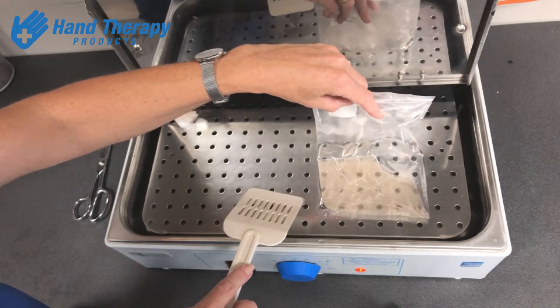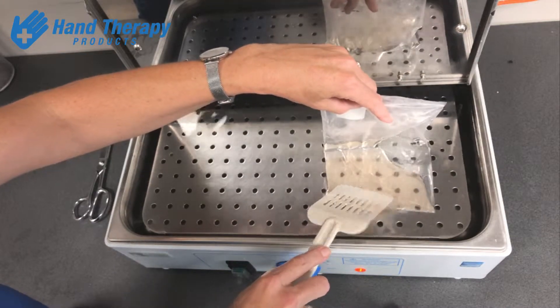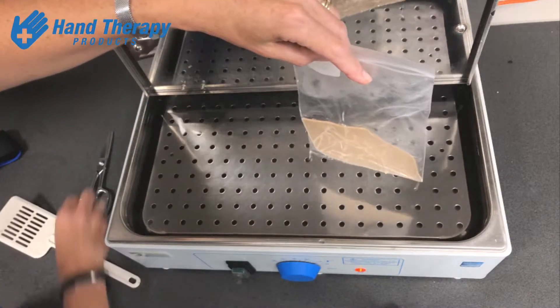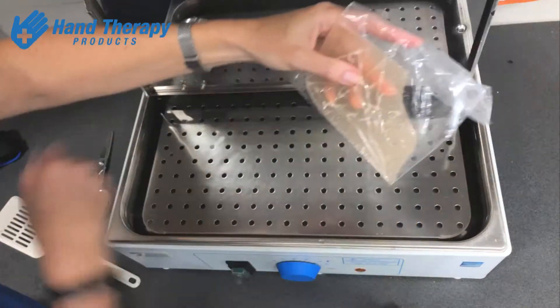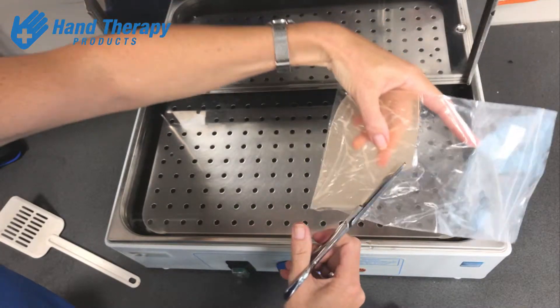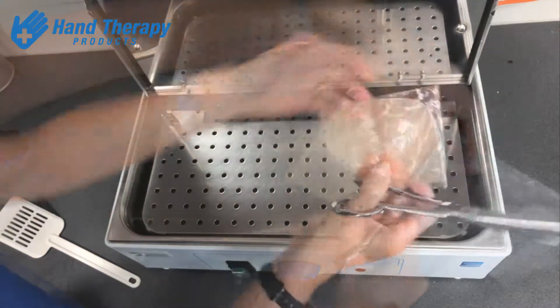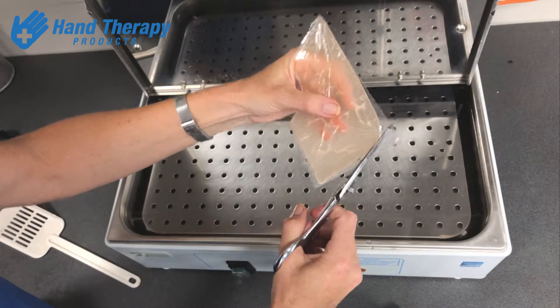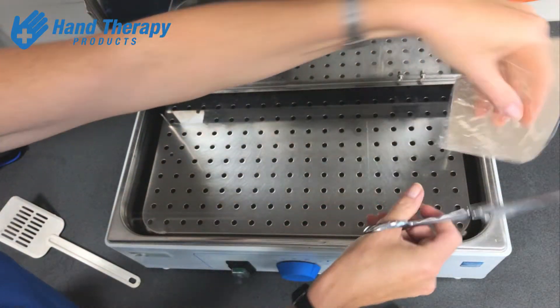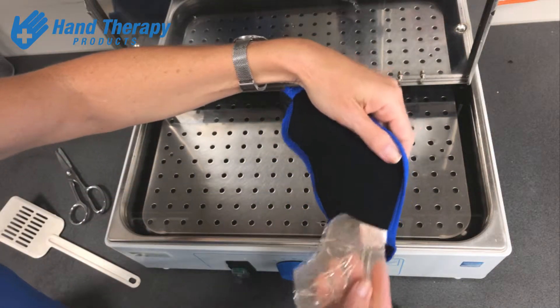You know that the plastic is ready to mold once it's gone see-through. Then you simply cut around that plastic with your scissors and insert that into the pocket.